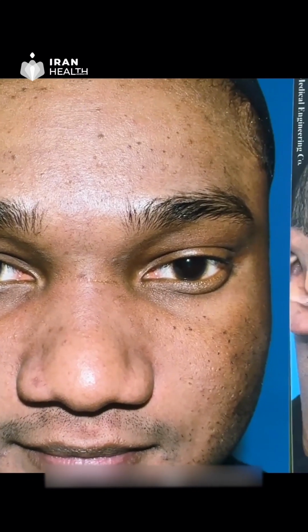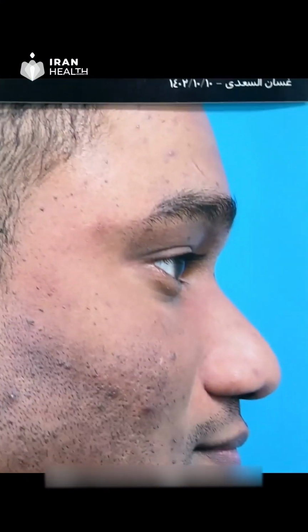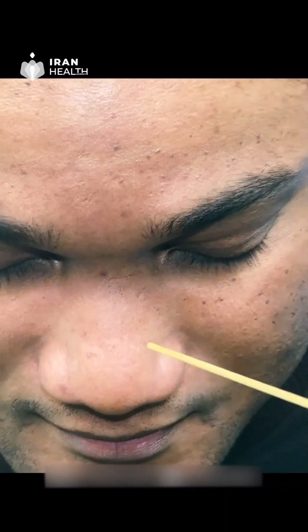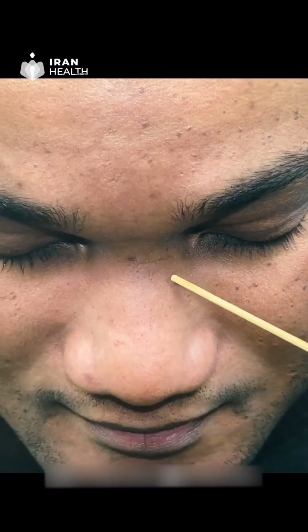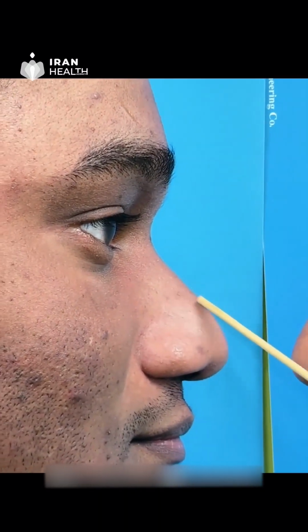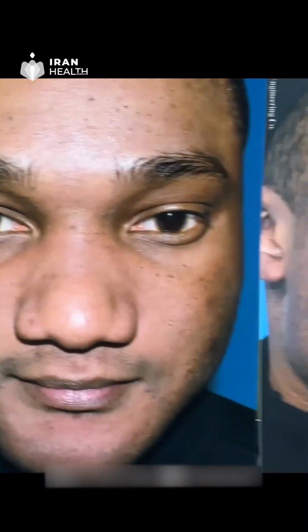The first one is that the width of the alar side walls will not be changed unless we can touch the base of this nasal bone with lateral osteotomy. Actually, with this deep radix and very short nasal bones, we are afraid of a collapse on the sides of the nasal bone, but if we use an ultrasonic device to keep the attachments of the upper parts intact, and also if we do not plan to open the dorsum of the nose, we will experience no collapse by touching these two and cutting the edges of the nasal bone to the cheek junction.